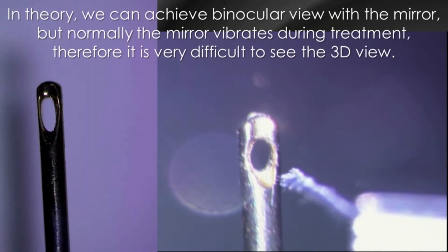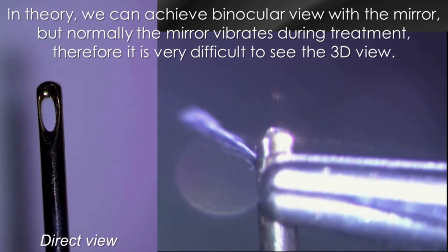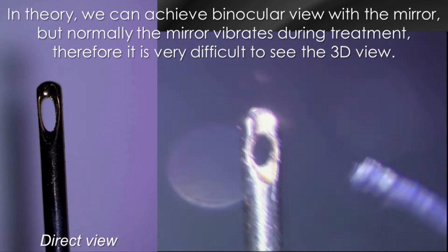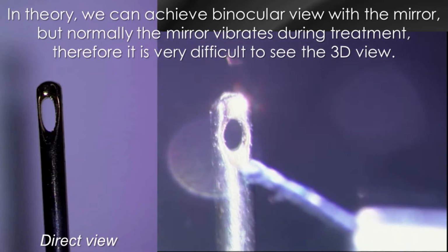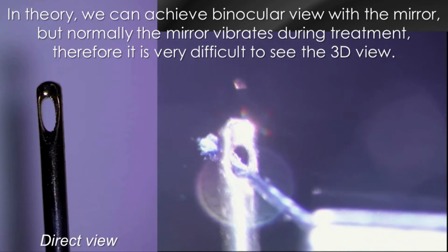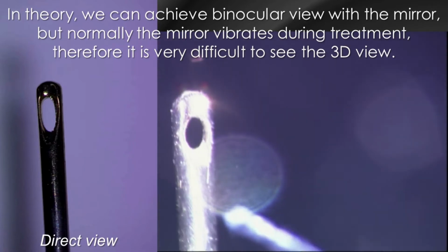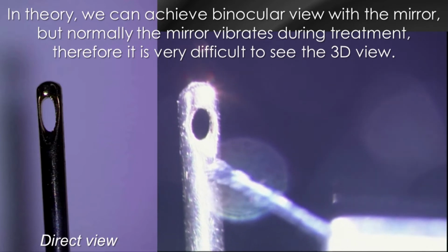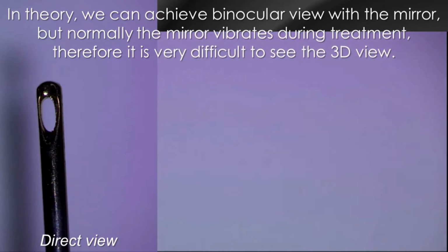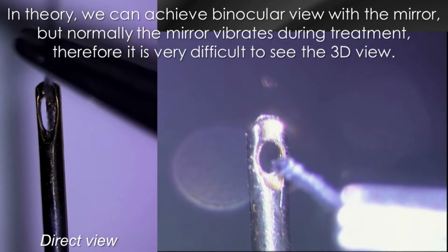In theory, we can achieve a binocular view with the mirror, but normally the mirror vibrates during treatment, therefore it is very difficult to see the 3D view. This is a mirror view. Left side is direct view.